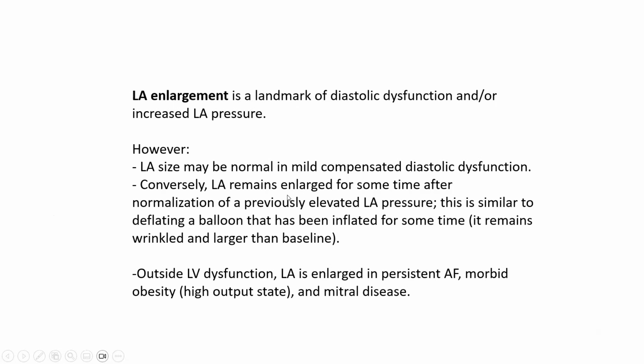LA may remain enlarged for some time after normalization of a previously elevated LA pressure. This is similar to deflating a balloon that has been inflated for some time. It remains wrinkled and larger than baseline for some time. So LA enlargement is highly common in diastolic dysfunction, but it doesn't always tell us that LA pressure is elevated right now. And occasionally, LA size may be normal in patients with diastolic dysfunction.